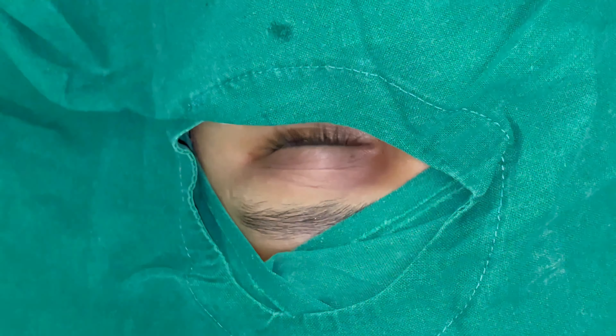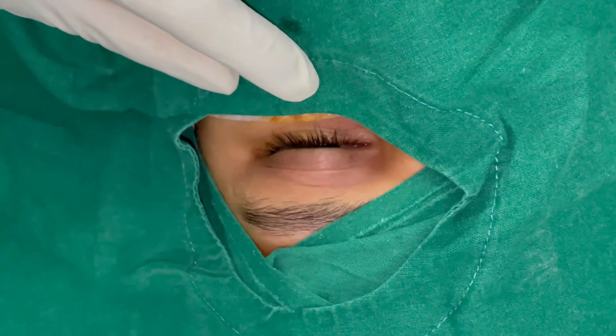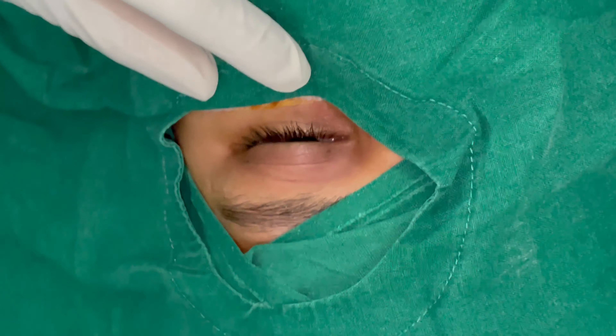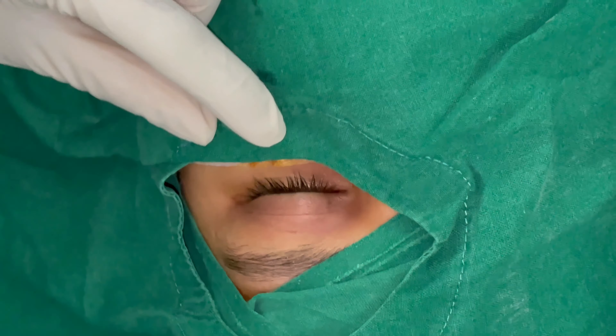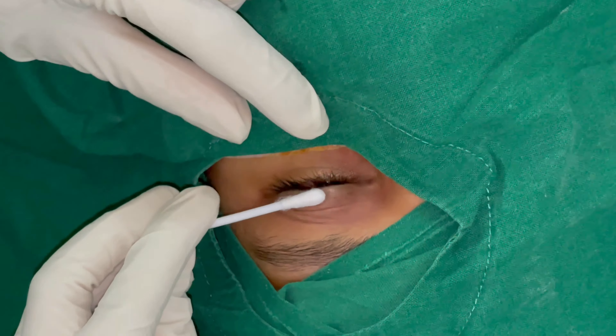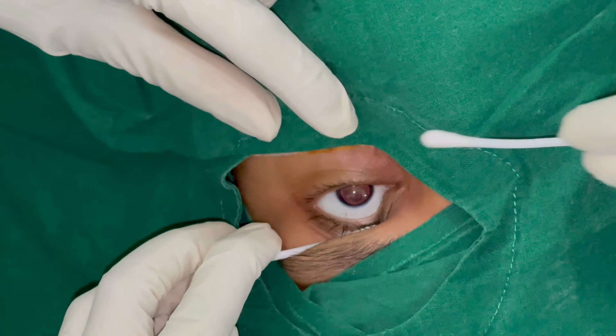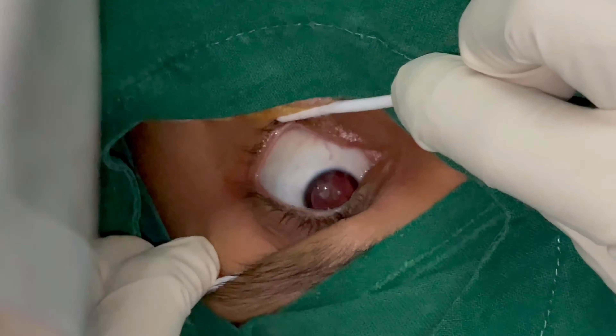When operating on a patient under topical anesthesia, draping may be slightly more challenging because of the patient's tendency to close and squeeze the eyes. The patient has to be explained what is being done — for example: 'Abhi hum kagas aapki aankh ke upar rakhenge, zor se band mat kariye, theek hai?' — before proceeding with draping.